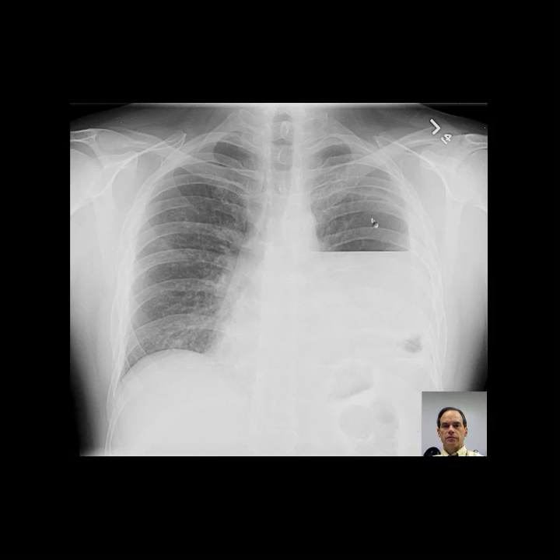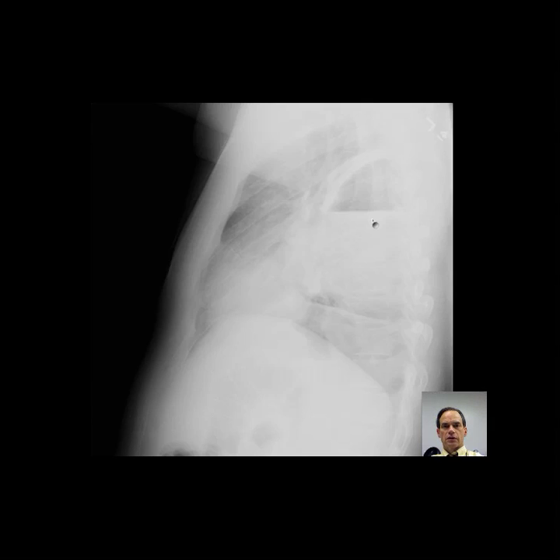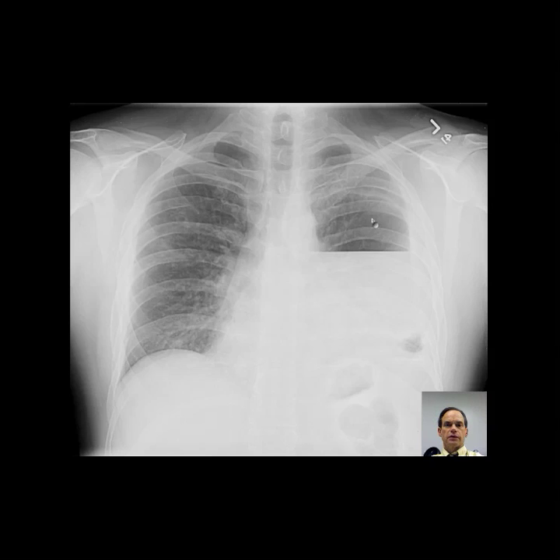The right lung is clear. Cardiac silhouette is within normal limits.